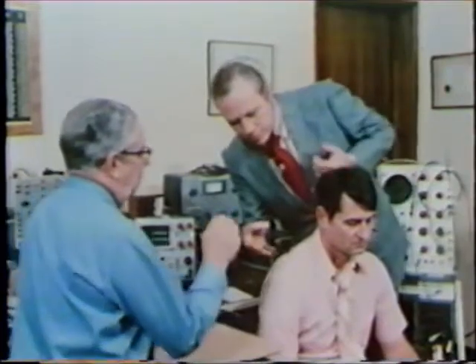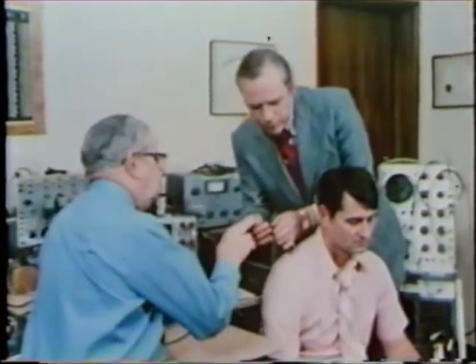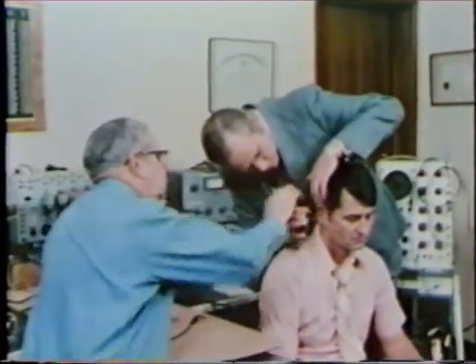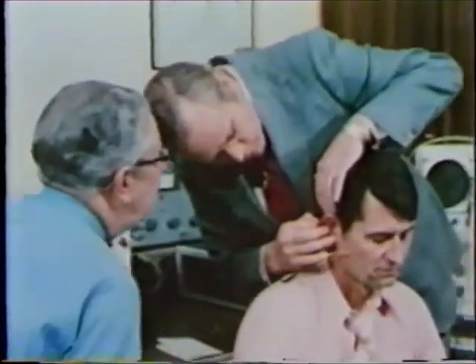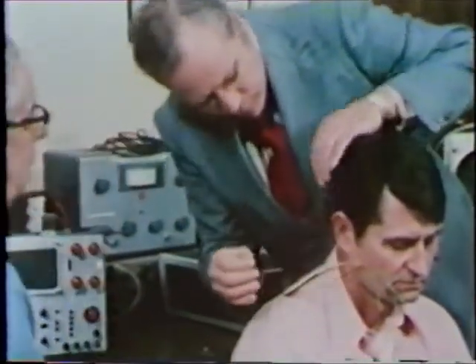Okay, Jack, let's plug these in. Now, the brown would be the number one electrode, which is this position right there. That's it. Okay, good. Brown is one.